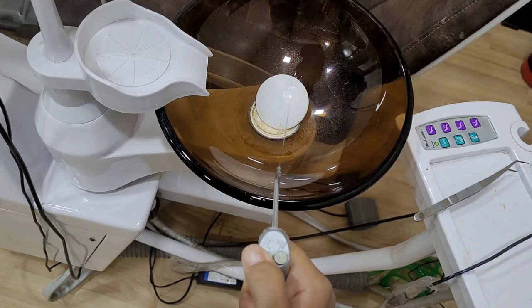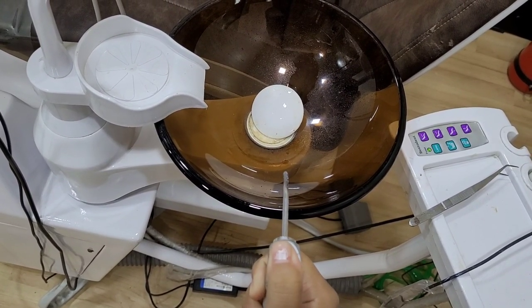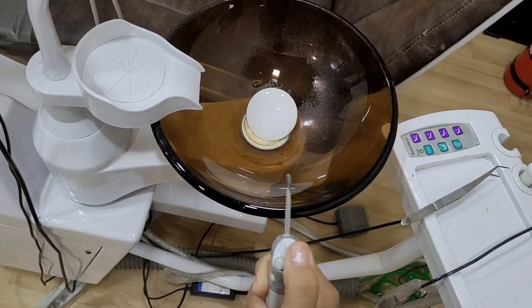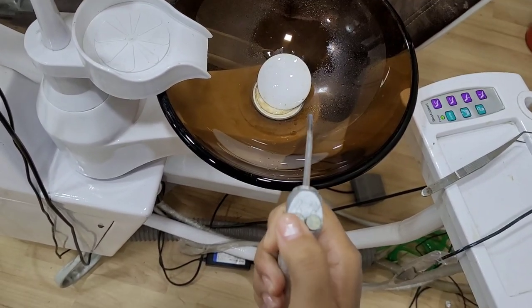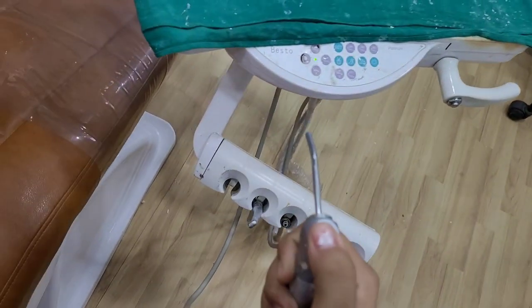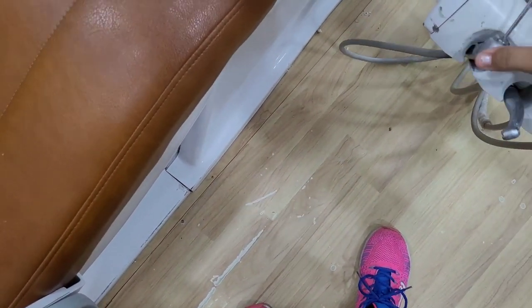If you press the left one, water comes out. If you press the right one, air comes out with air pressure. If you press both together, you get a spray of air and water combined. So this is the 3-way syringe.